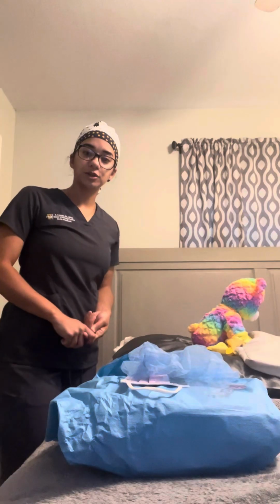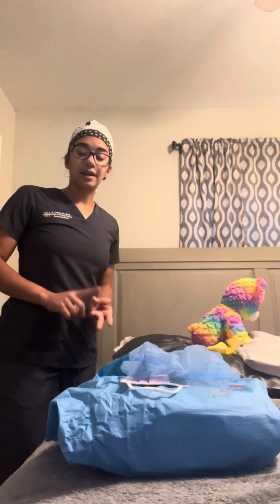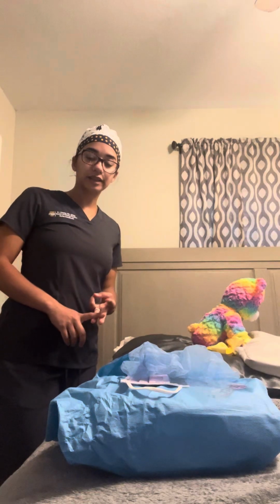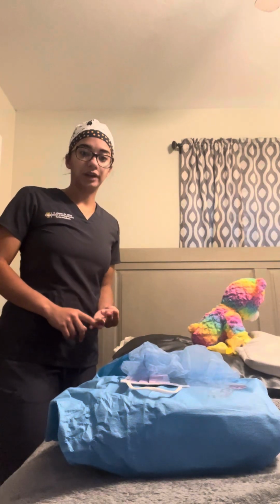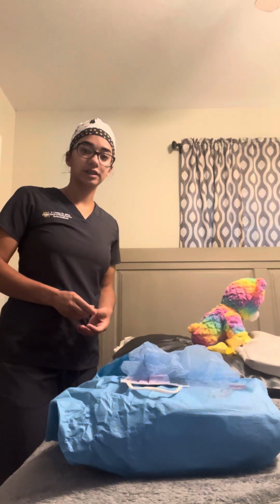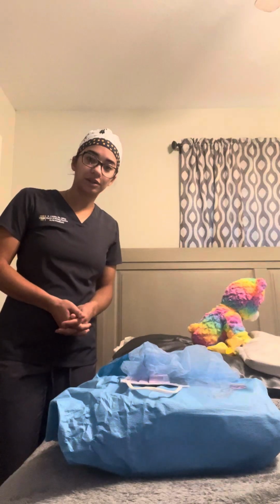Hi, I'm going to be simulating an epidural catheter insertion. Before beginning, I'm going to review the patient's chart to look at their INR, their platelet count, their anticoagulation status to ensure that there are no contraindications for this procedure. I'm also going to look at their allergies, and before beginning, preload the patient with 500 to 1 liter of crystalloid fluids.